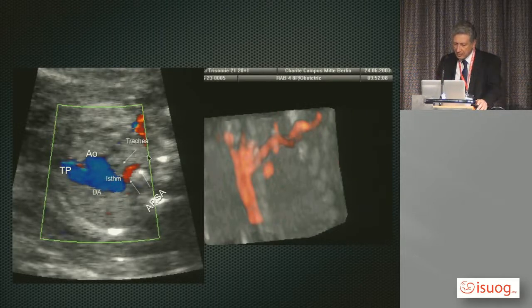And I took the book again, and I saw this. I said, this could be a sign. And I rendered on color Doppler. At that time it was very popular to do everything with 3D. And yeah, it turned out to be true. And we terminated the pregnancy, and it was Down syndrome, of course.